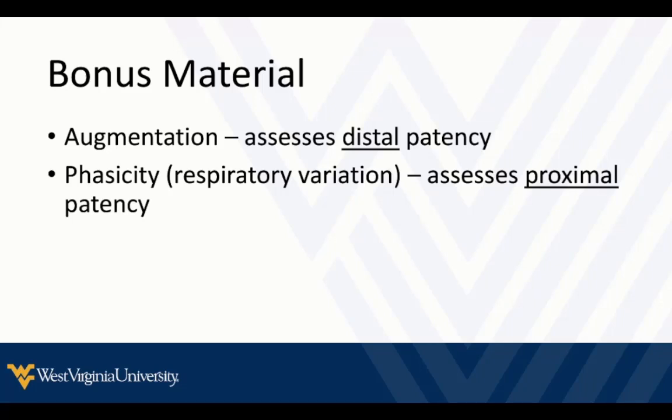So I'm going to show you a few additional techniques you can use in more difficult cases or where cases kind of seem equivocal. You don't need to use this in every case. That's straightforward and easy. But if you have a difficult case, these additional techniques can add information to the diagnosis.